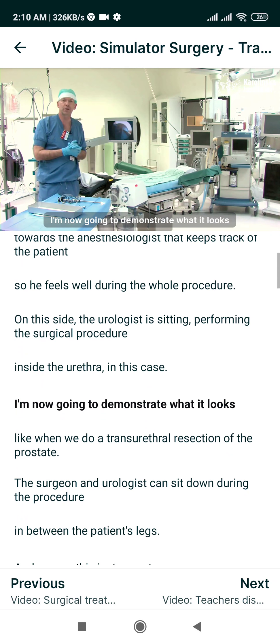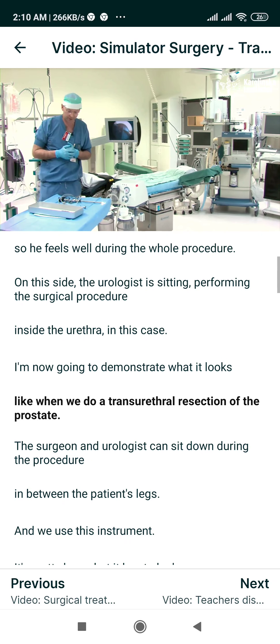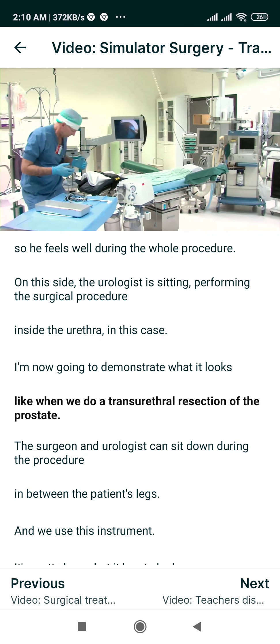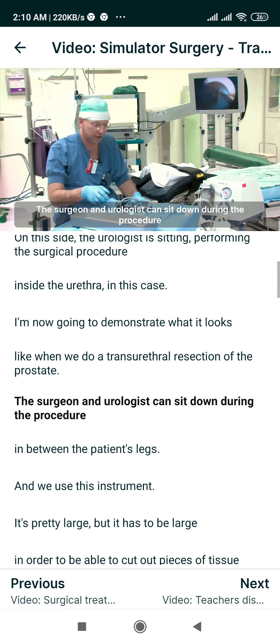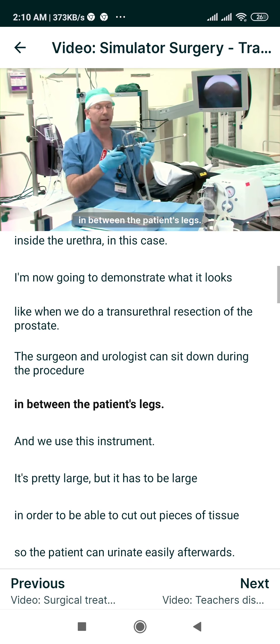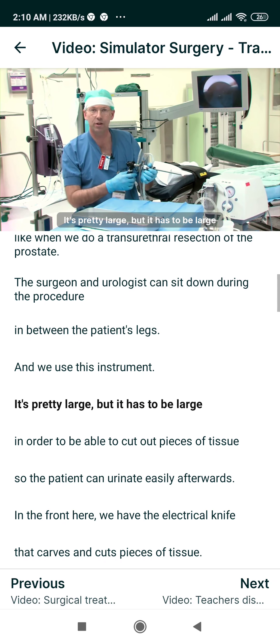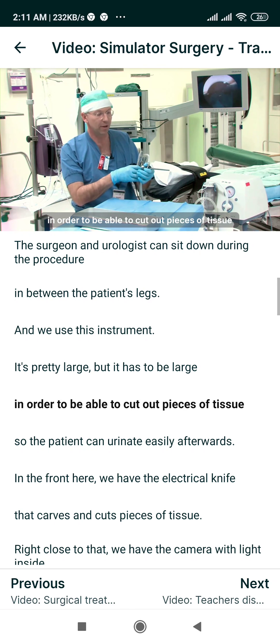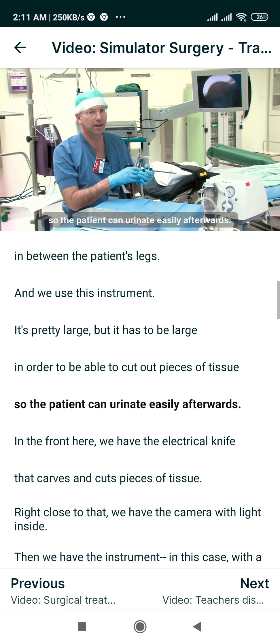I am now going to demonstrate what it looks like when we do a trans urethral resection of the prostate. The surgeon and urologist can sit down during the procedure in between the patient's legs and we use this instrument. It's pretty large, but it has to be large in order to be able to cut out pieces of tissue so the patient can urinate easily afterwards.